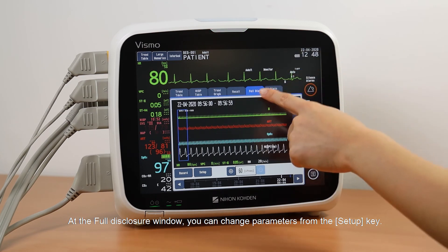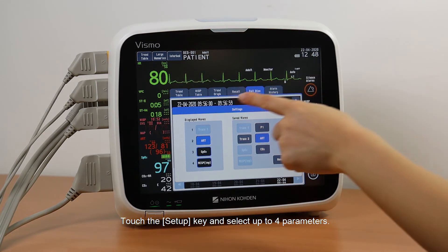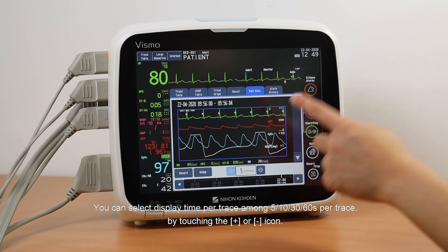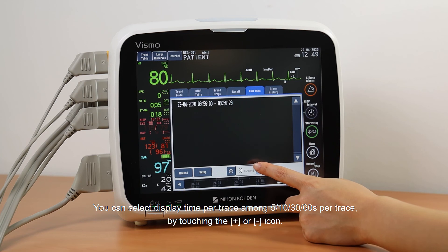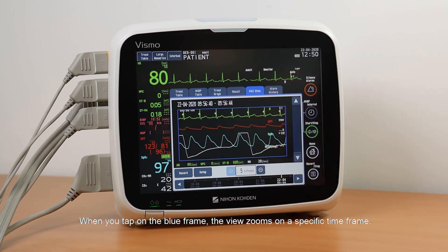At the Full Disclosure window, you can change parameters from the Setup key. Touch the Setup key and select up to four parameters. You can select the display time per trace among 5, 10, 30, or 60 seconds per trace by touching the plus or minus icons. When you tap on the blue frame, the view zooms in on a specific time frame.